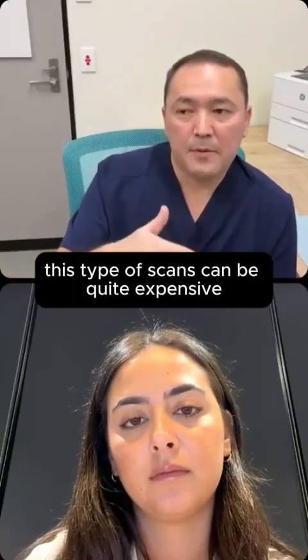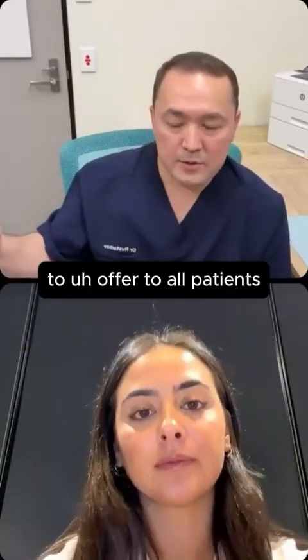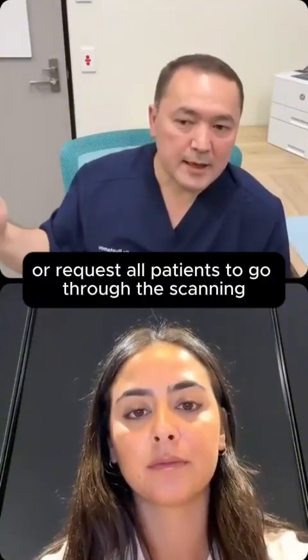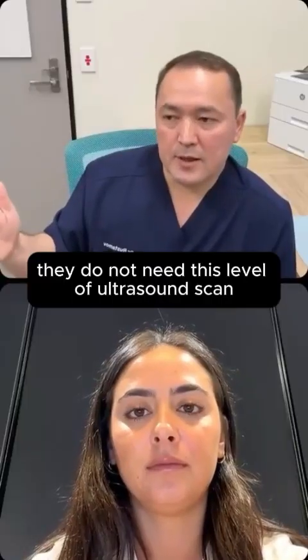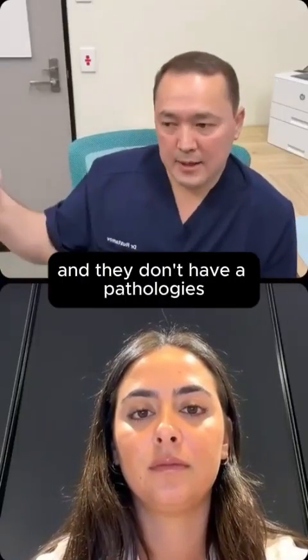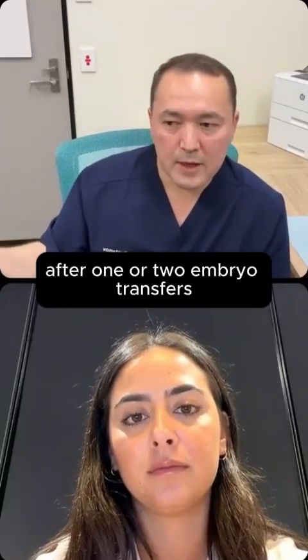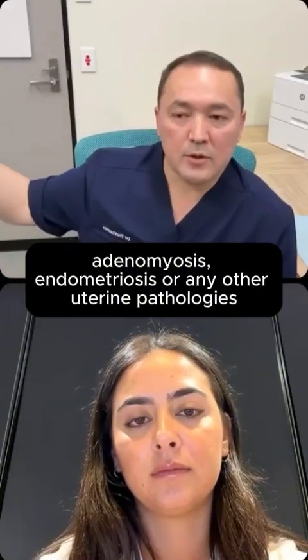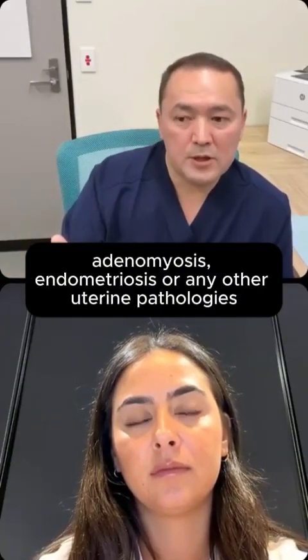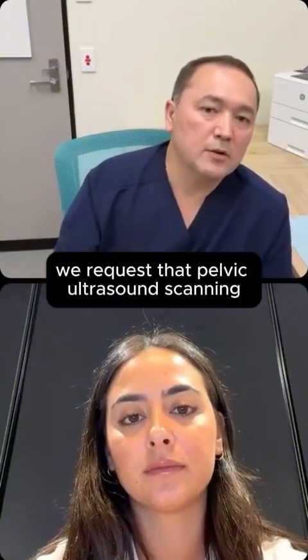Because this is a very thorough scan, depending on which country you live in and your level of insurance cover, this type of scan can be quite expensive. So it's generally not indicated to offer or request all patients to go through the scanning, because a lot of patients do not need this level of ultrasound scan, and they don't have the pathologies we mentioned earlier, and they get pregnant easily after 1 or 2 embryo transfers. But in patients with repeated implantation failure, adenomyosis, endometriosis, or any other uterine pathologies, we want a very thorough examination, so we request the deep pelvic ultrasound scanning.